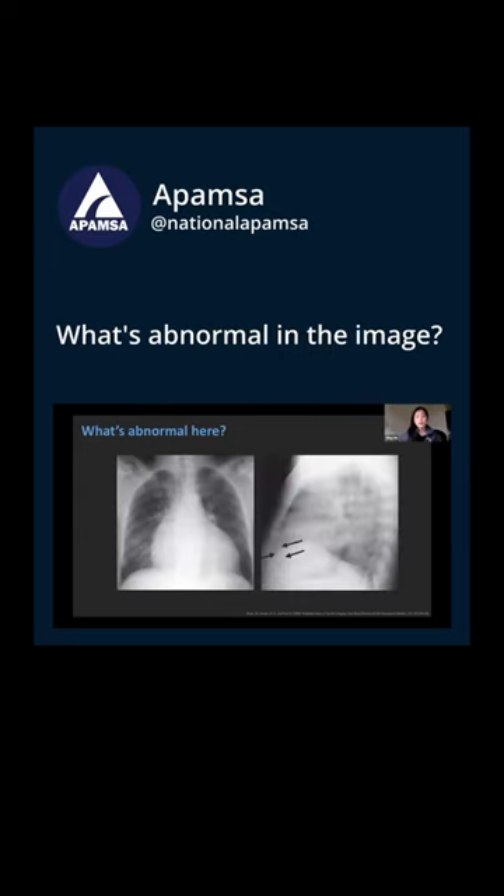So what's abnormal here? The heart looks big, and so you would say globular enlargement of the cardiomediastinal silhouette. It doesn't look like there's any pulmonary edema. There's no fluid and the costophrenic angles are sharp.